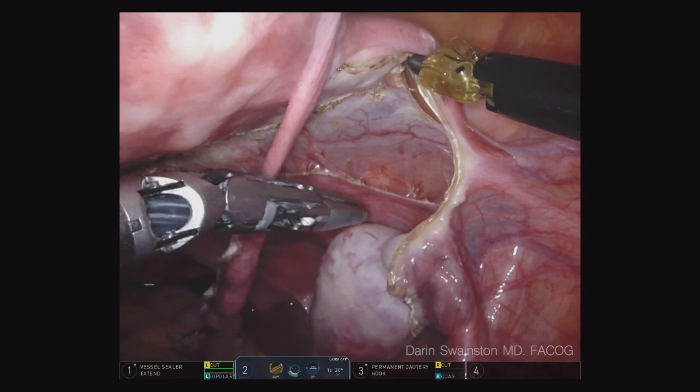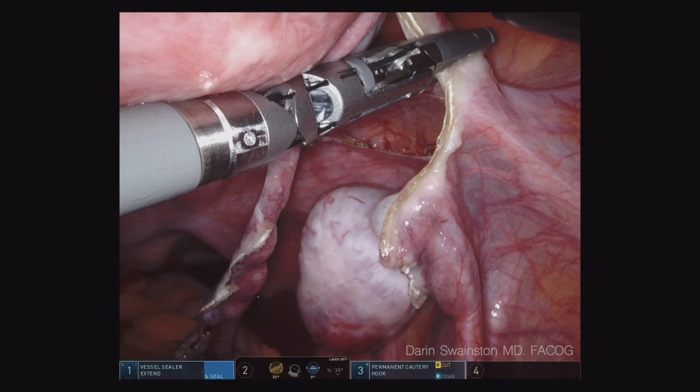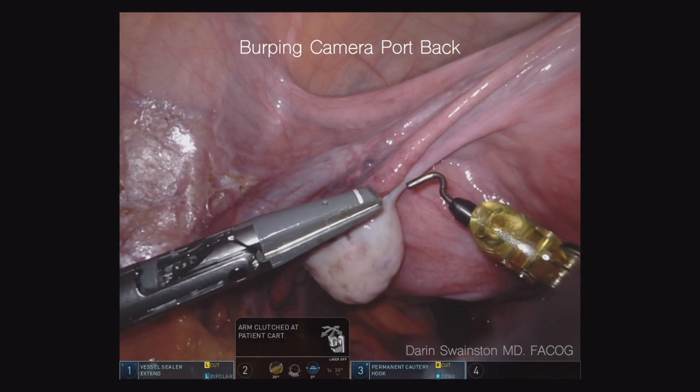Notice that movement up and out — that's the only time I then cut the round ligament. You want to take advantage of that round ligament as a way of dissecting. Same thing happens on the other side. Try to pick an avascular area. We're going to pull the camera back. We use the 30-degree down — it just gives us more options.